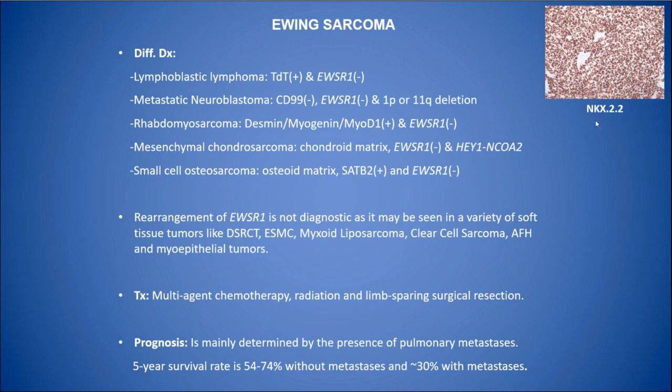Another marker that is pretty sensitive but non-specific is NKX2.2. It is very useful. Unfortunately, like CD99, NKX2.2 has been detected in other tumors that are not Ewing sarcoma. So, when you use it, you have to be careful, as well as you are with the CD99.